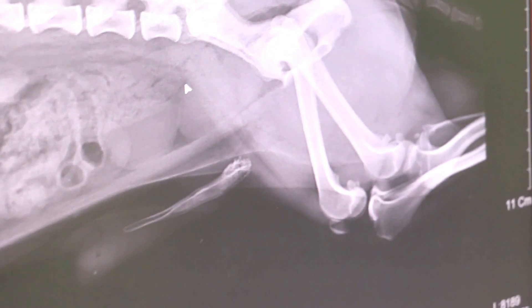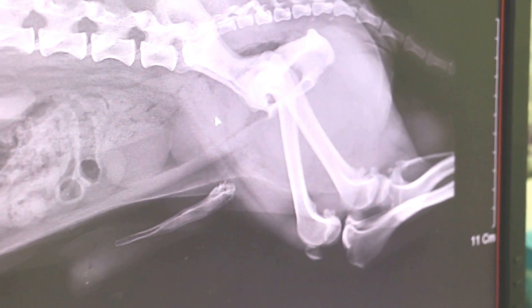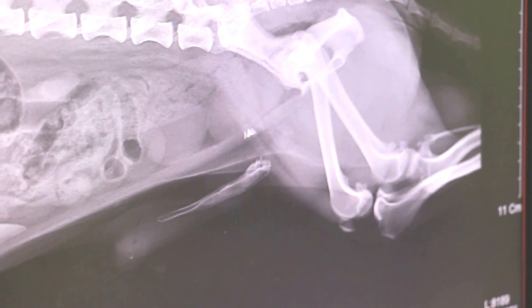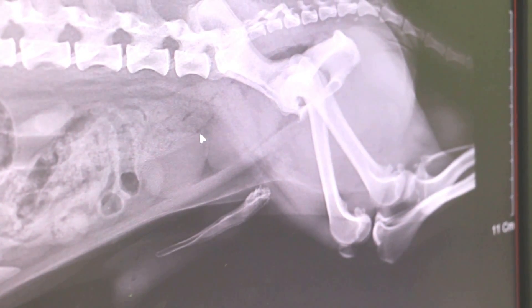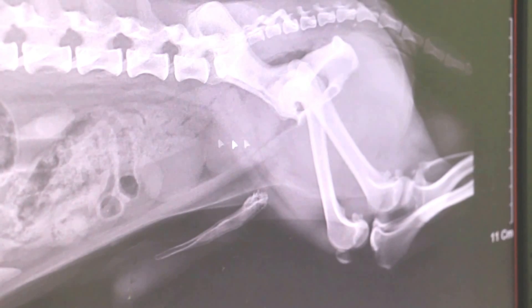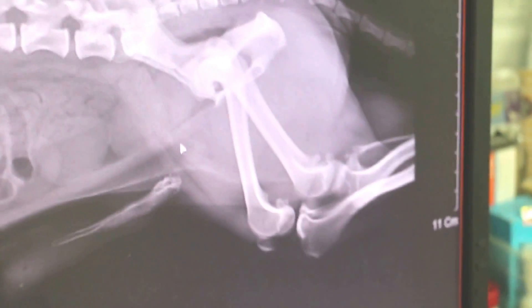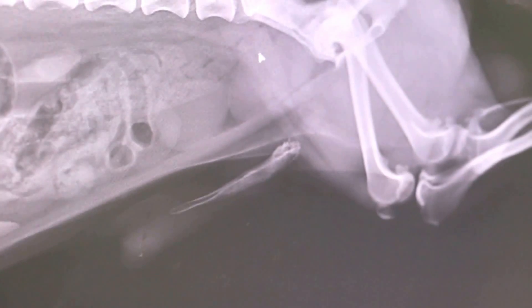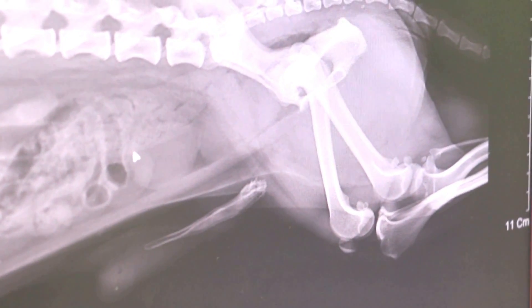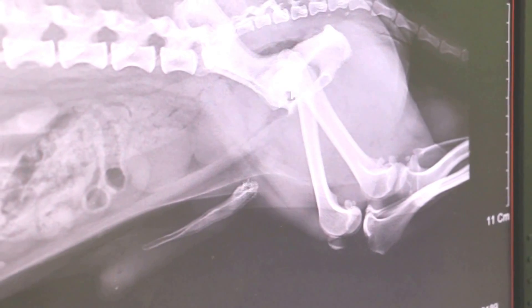The prostate normally you can't see at all, but now you can see it. If the dog were neutered, sterilized, or castrated, there would be no enlargement, because it's normally due to hormones and testosterone. So this is prostate enlargement, and the blood in the urine could be due to prostate inflammation as well as bladder inflammation — that's why the dog dribbles blood in the urine now and then.